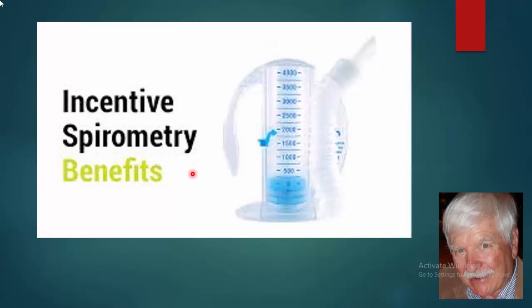But the whole purpose of this is called respiratory therapy, which is to keep your lungs from getting infected. People often get pneumonia and other respiratory infections after surgery, and so having an incentive spirometer and using it off and on whenever you feel like it helps. Sometimes it hurts to do it, so people don't feel like doing it. But the more you do the incentive spirometry, the less likely you are to get a nasty lung infection.